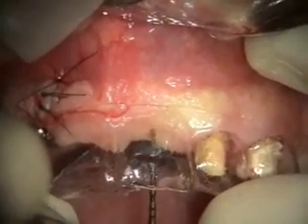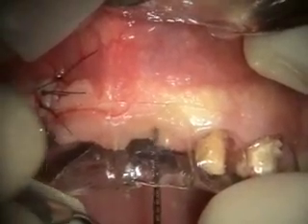I'm going to use my stack to find my center here. It's pretty much at the center of this ridge.